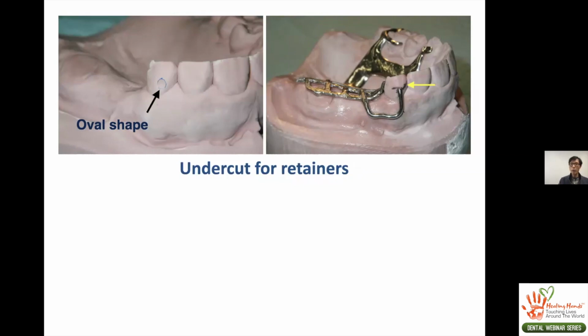And when the partial is removed, the I-bar, instead of digging into the enamel, can be displaced gradually without catching or digging into the enamel. That way, the removal can be more gradual, and there's less chance of wearing of the enamel.